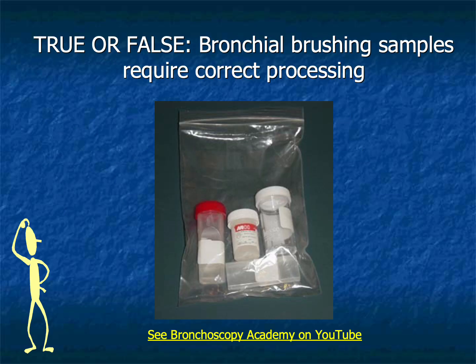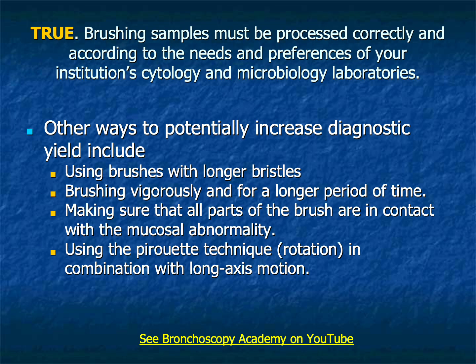Specimen acquisition represents only part of the diagnostic process. Specimen processing matters equally. A perfectly obtained sample may become diagnostically useless if it's handled incorrectly. Communication with cytology and microbiology laboratories, therefore, becomes part of the procedural competence journey. The airway sample enters a larger diagnostic system involving technicians, laboratory staff, cytopathologists, and clinicians. Bronchoscopy depends upon collaboration. Often, the bronchoscopist is a team leader.